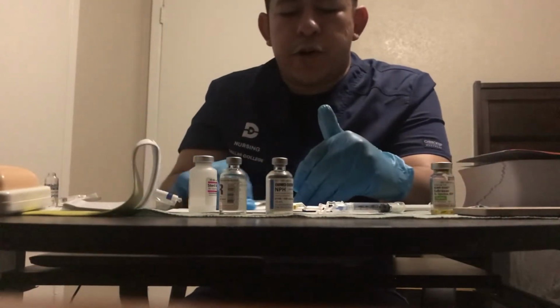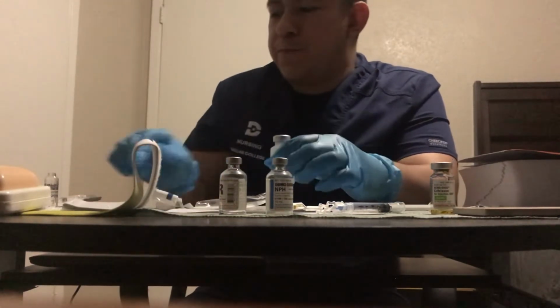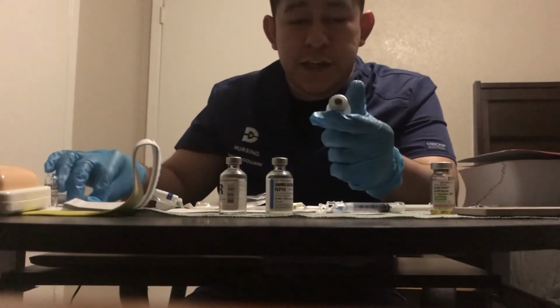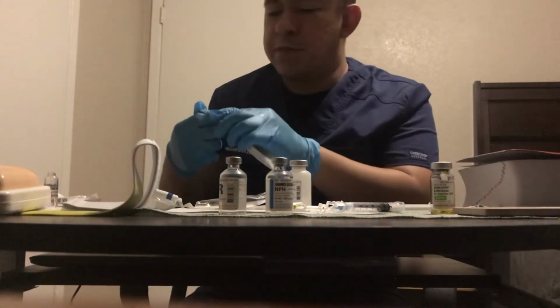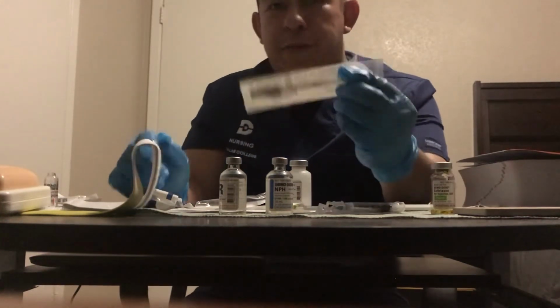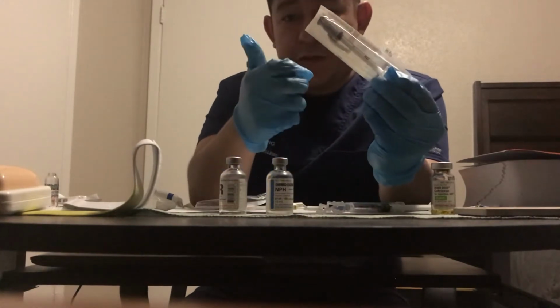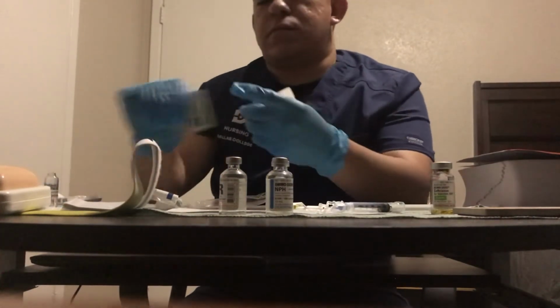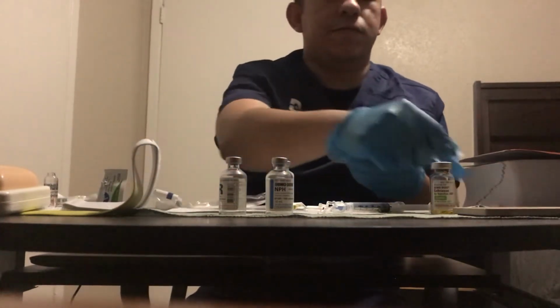Next up, we're going to draw up our PPD. So second medication check for PPD. This is indeed PPD, and I will be drawing up 0.1 mLs. This is for Jack Buzzard. I'm going to grab my TB syringe. I'm going to pop the top off of this as well. Make sure you clean that off with an alcohol wipe.